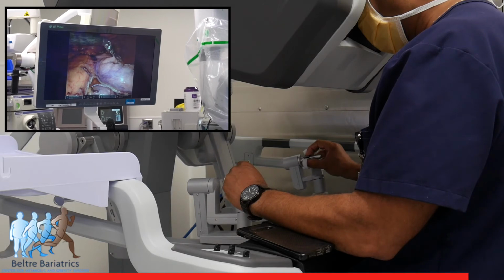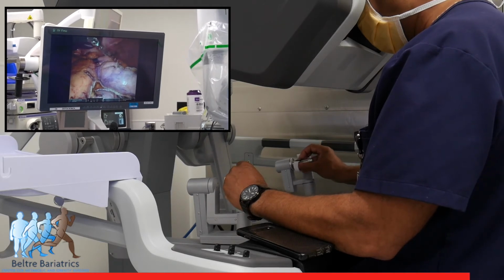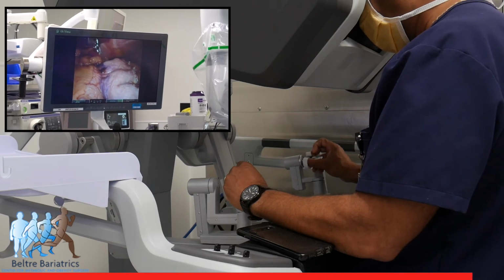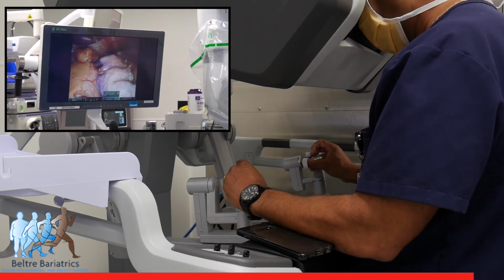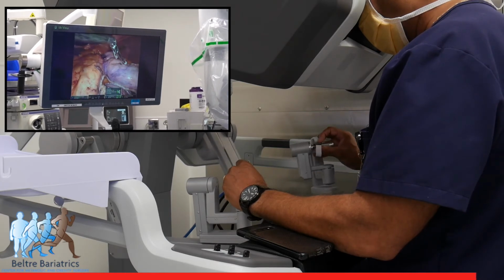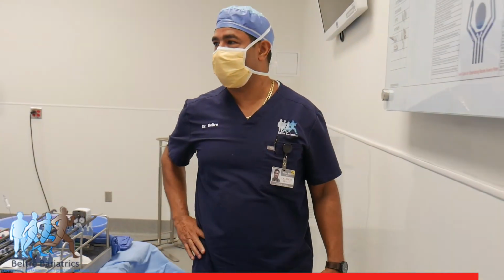Ahí pueden ver cómo estoy agarrando los tejidos con la mano del robot y voy haciendo la cirugía. Esta es una manga gástrica, me parece que hicimos. This is a gastric sleeve that we did robotically. You can see how I'm handling the tissue, and I can control stapling very precisely through it. All right, that's the robotic sleeve.